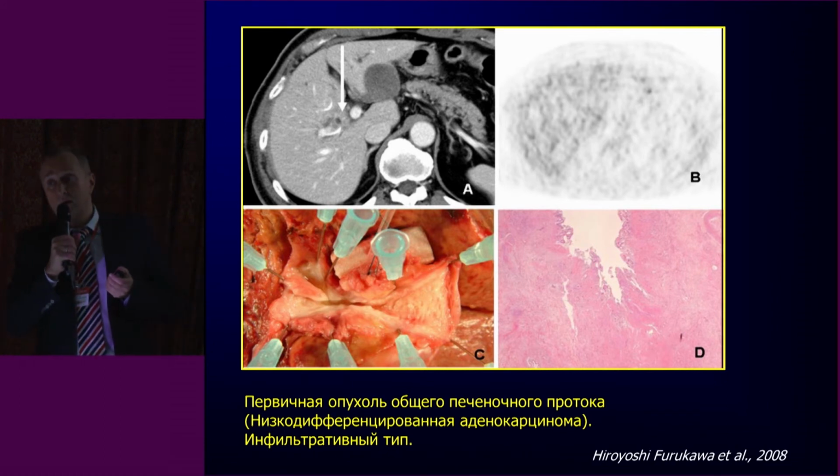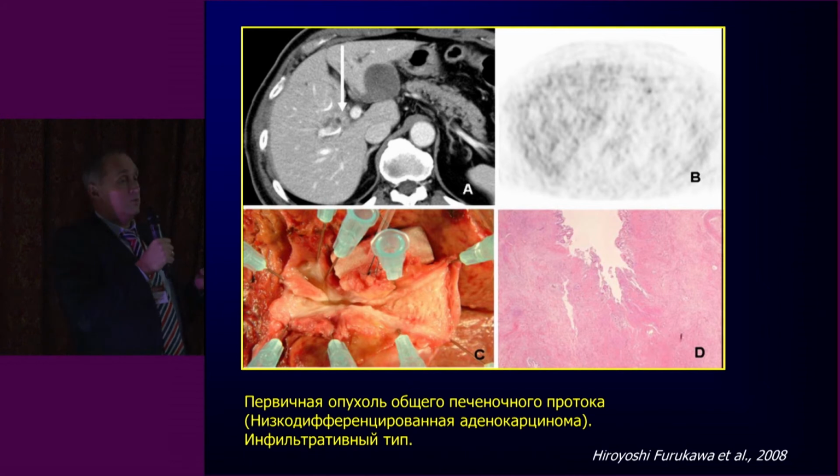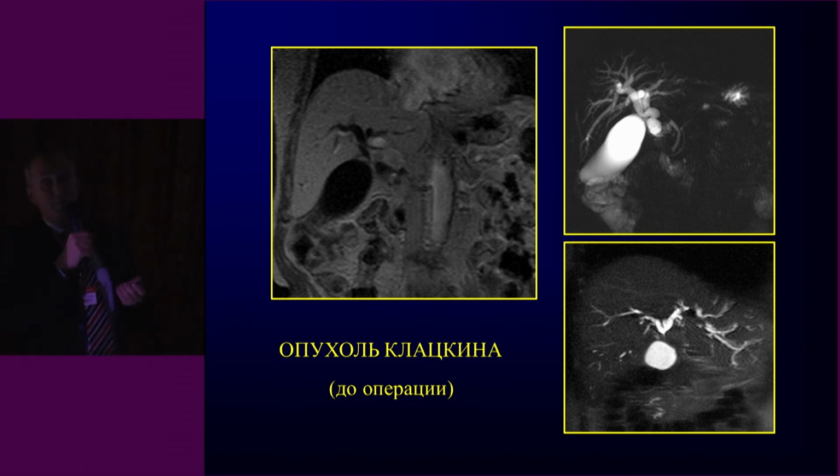When we study with FDG, we should understand that the primary diagnostic driver here is clinical science, and PET should not be the reason to change the patient management. That's our patient, our colleague, the nurse. We diagnosed that she has some problem in the confluence area. We confirmed Klatskin tumor.